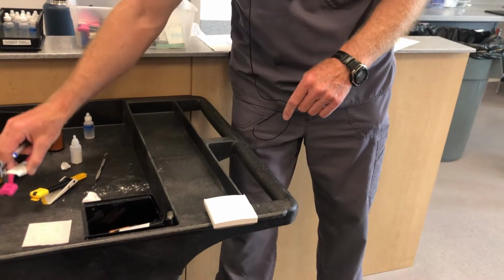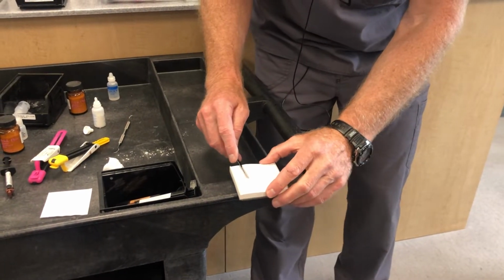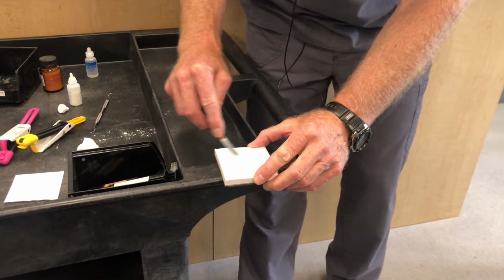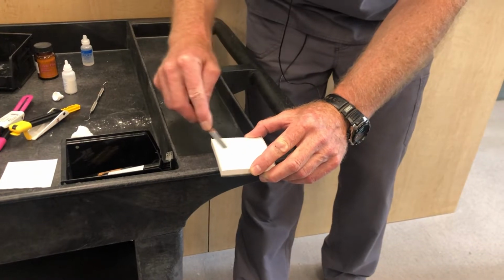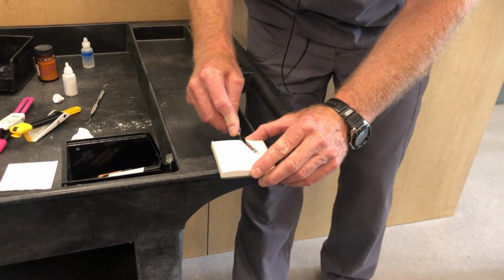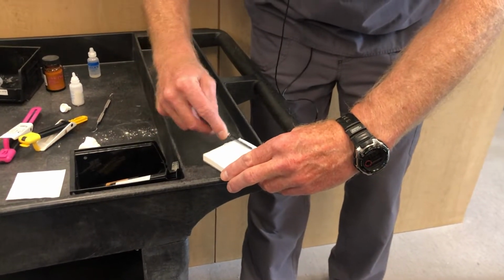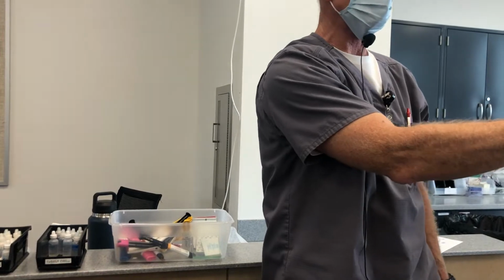Both of these resin-based cements need to be mixed a minimum of 20 seconds rapidly. So your assistant should grab those. So rapid mixing, and usually you're going to have twice as much as I'm using. Then gather it up. So again, twice as much as that. Go 20 seconds, and then again, you're going to have twice that amount. That's half as much as you need for a crown. Hold your crown upside down. Just wipe it into it so the entire amount goes down inside the crown.